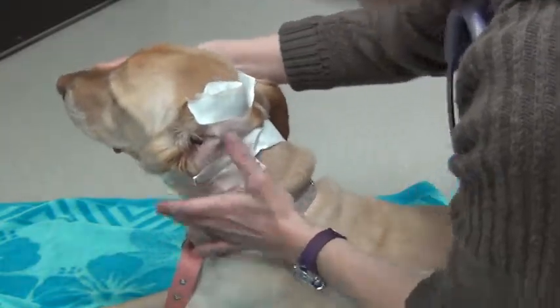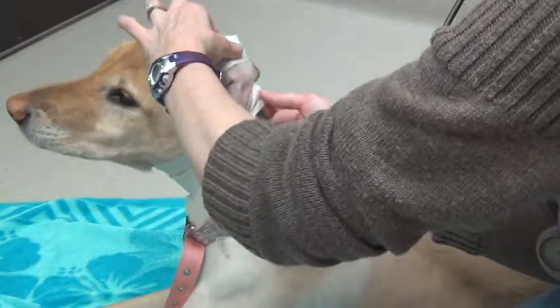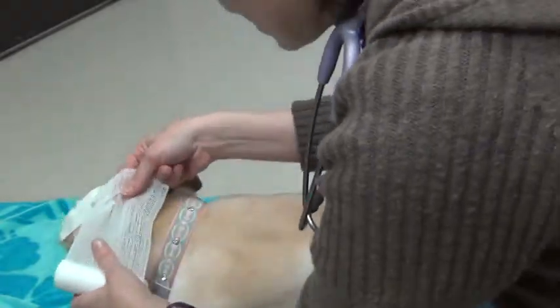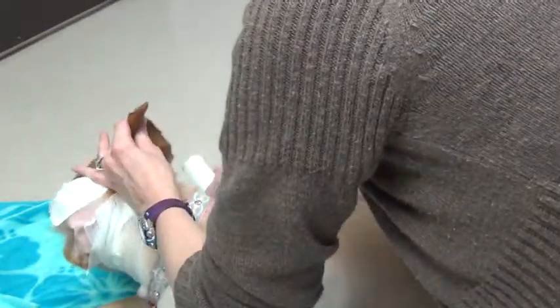Okay, so you see this part? The ear is up and exposed and open. Here, being a good girl. Okay, so the next part is going to be the roll gauze. We're going to go ahead and start that. We'll be going under the ear first, and I'm going to avoid the other ear. I don't want to take the other ear, so it's uncovered.